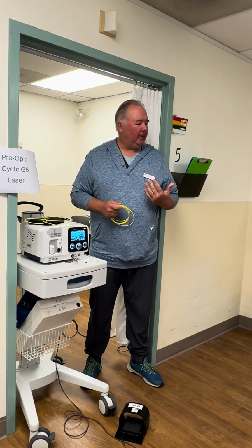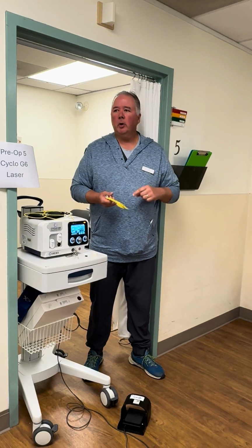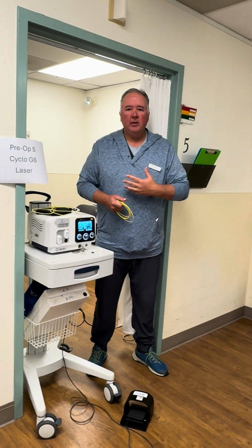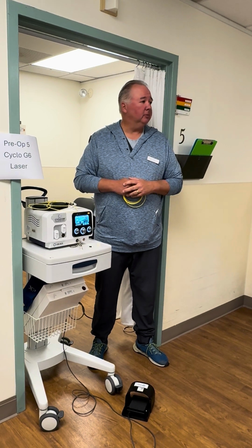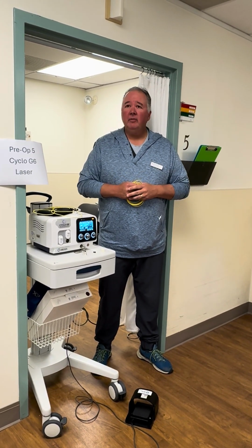So that's one of the nice things about micropulse, is that it is repeatable. It's kind of like a lesser known therapy for glaucoma. A lot of doctors will go right to a certain device, or they'll add a drop. We're kind of out there trying to promote micropulse because it is an option for the patient to try and wean off some drops. So that's kind of it.